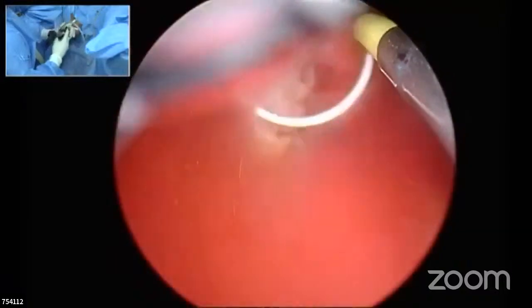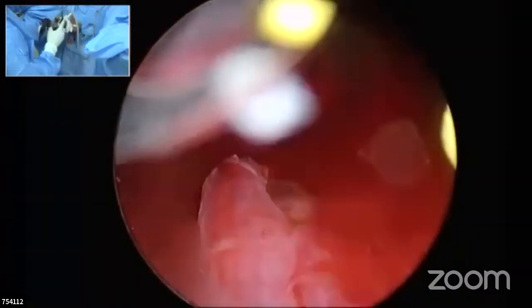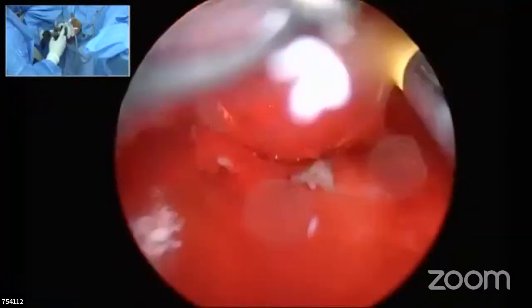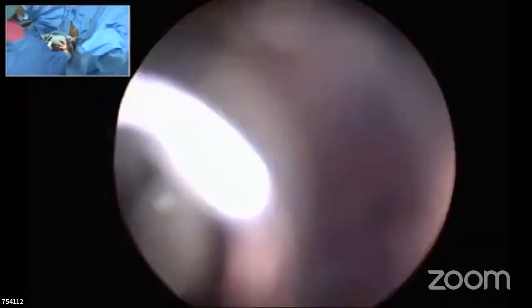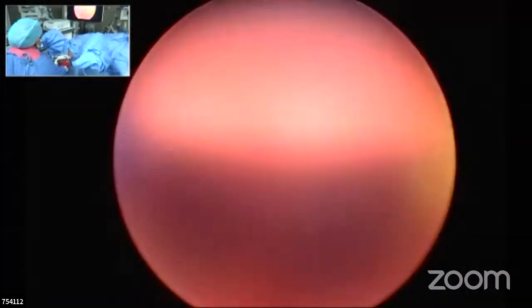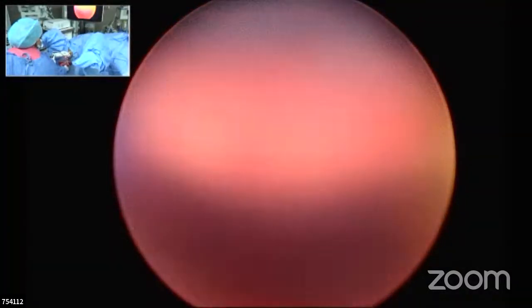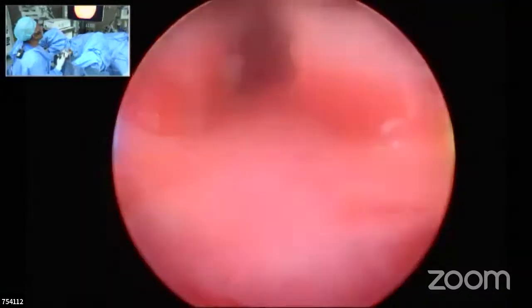To create that boat shape, it is not your right hand that needs to be used. It's your left hand. Keep your left hand active. That will give you better control than the right hand. If you are cutting and also creating a boat shape at the same point of time on the right hand alone, that is going to be quite strenuous. So use the left hand for creating that boat, and the right hand to cut, which will be a better way of doing it, sir.